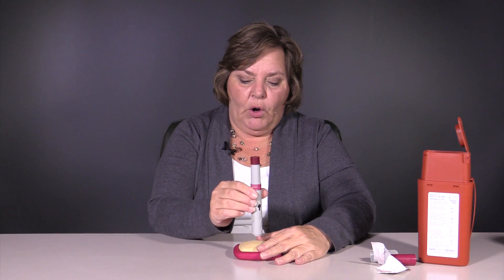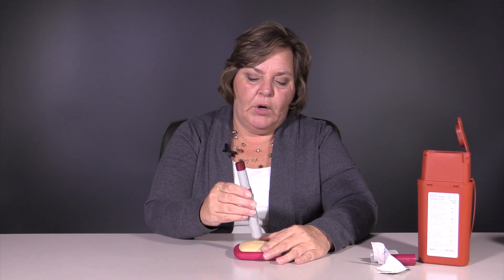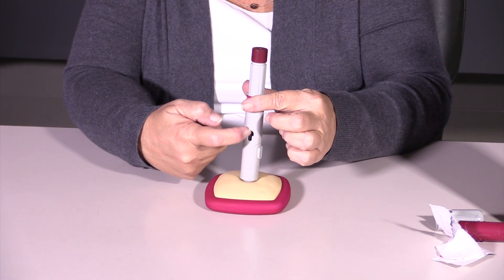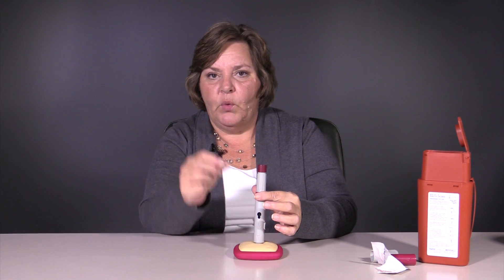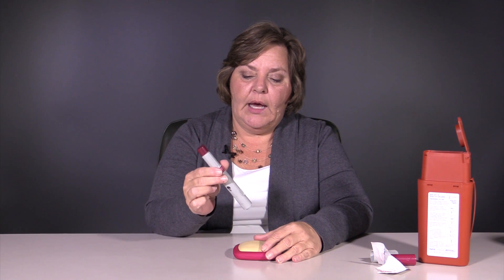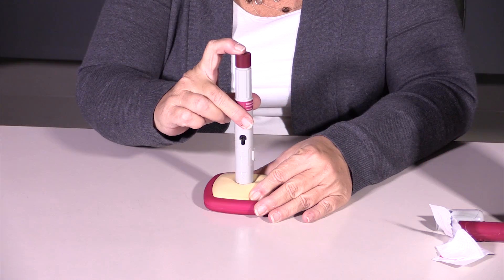Now, you're just going to hold this firmly against the skin and click your trigger. Before I do that, I want to show you that there's a clear area here where you would be able to see the medication, and that area is going to fill with a yellow indicator once your medication is dispensed. So we click.